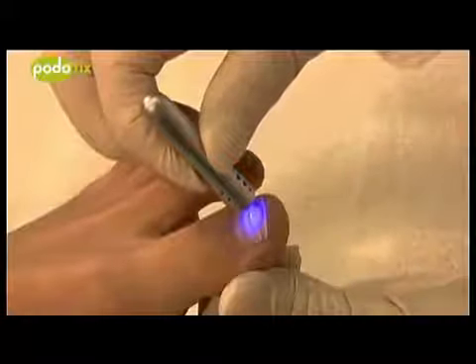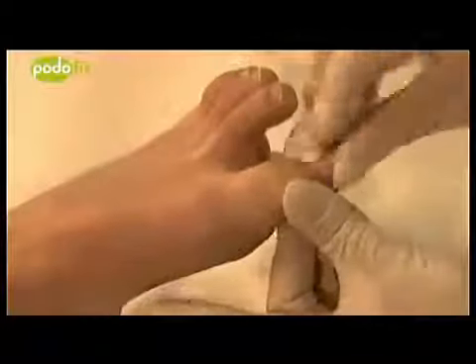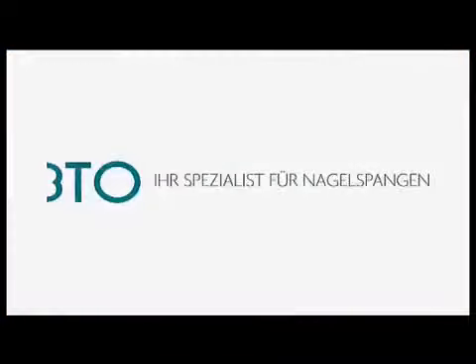During hardening, an oily layer will form on the surface of the gel, which can be easily removed using the alcohol swab. Nail edges are removed if required, and the nail crease is then plugged or treated as one would a wound, depending on the situation. The brace is removed using the side cutter at the edges, and any remaining adhesive can be removed from the nail using a file or a milling device.